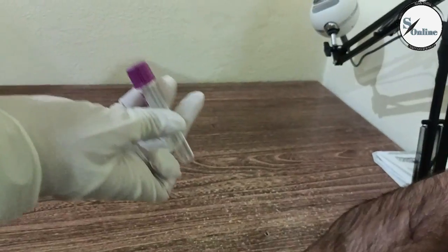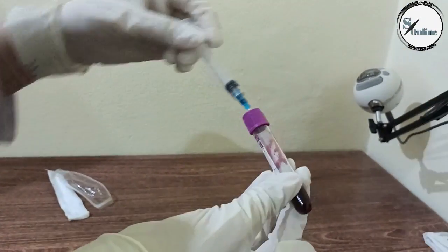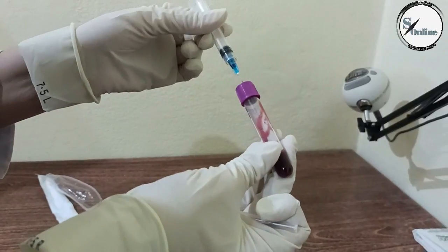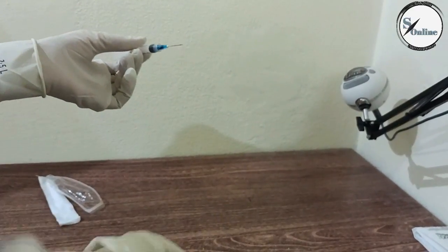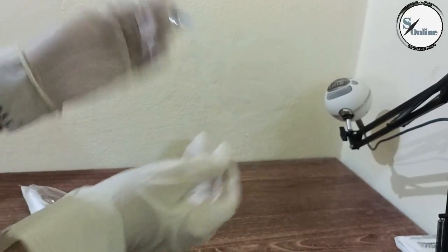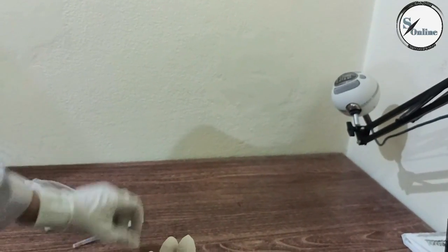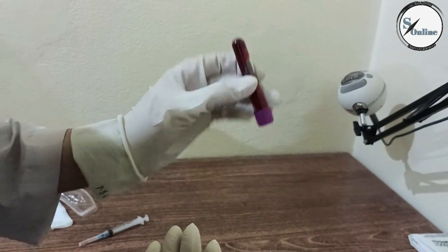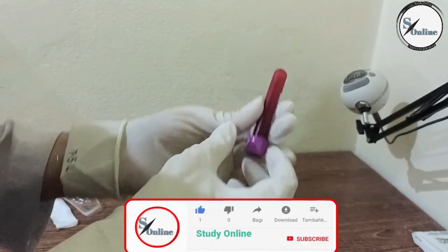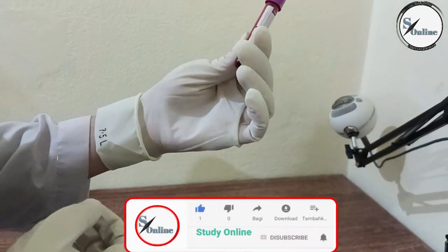Now we will put it in this place. We have to be careful with our hands so that the syringe needle does not stick. We will put the needle in the discard container and discard it safely. This is the blood sample — let's shake it so that it won't clot. We have the blood sample for blood group.